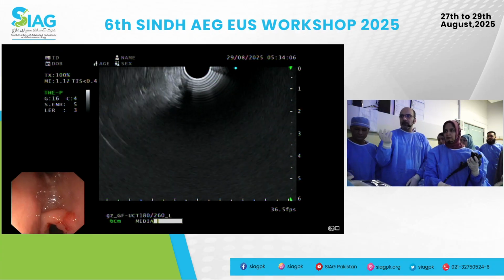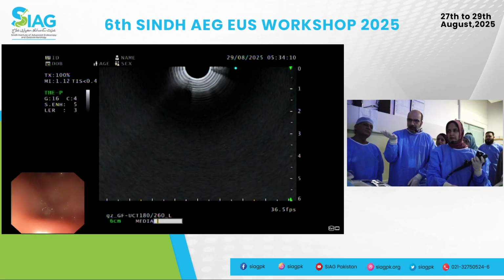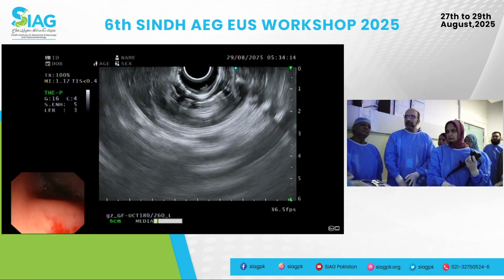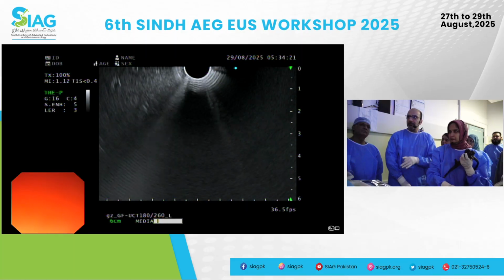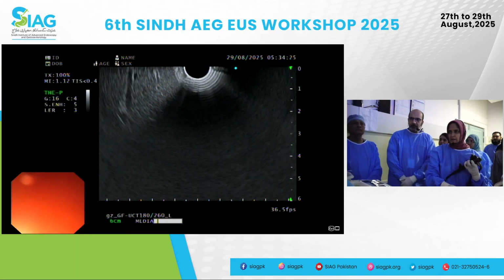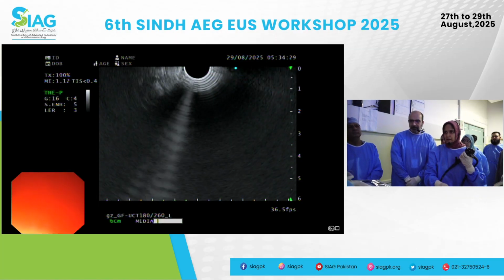Pull back, put the balloon up. Before you go in, come back. Put your balloon up. Okay, there's water. Now suction, push all the way down on your suction button. All the way down. Okay, suction the scope. Good. Now pull back and look where you are, and then go back into the duodenal bulb. We'll try this one more time. Pull back. Again, reset.